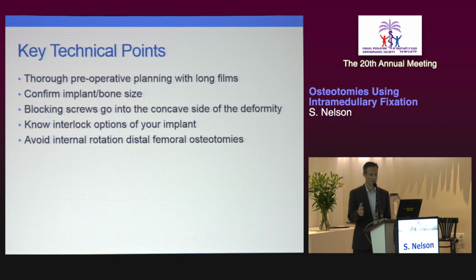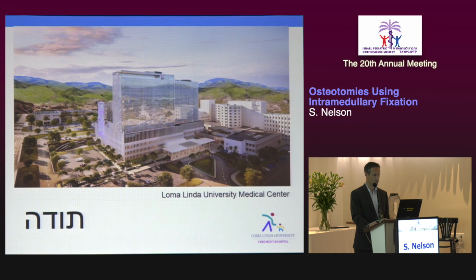Blocking screws go into the concavity of the original deformity. Know the interlock options of your implant and what level you need to make your osteotomy, and then avoid internal rotation for distal femoral osteotomies.